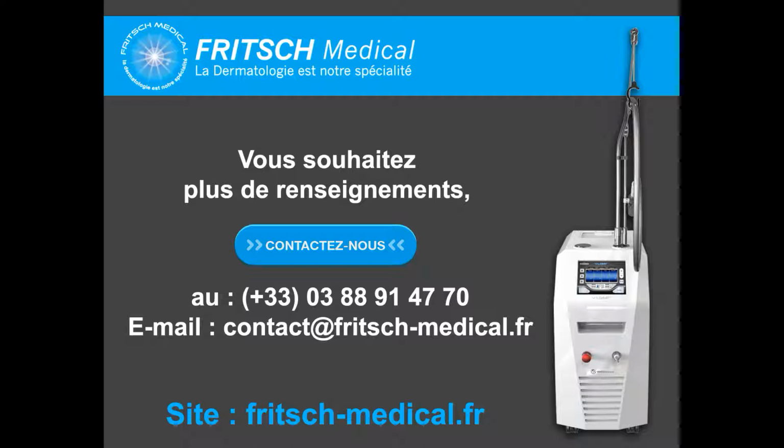Okay, good to know. And how many passes do you deliver for a skin rejuvenation procedure? Good question. For dark spots, you put your setting at maybe 4 or 5 milliseconds, maybe 6 joules with a diameter of 5, and you see the dark spot and you shoot.